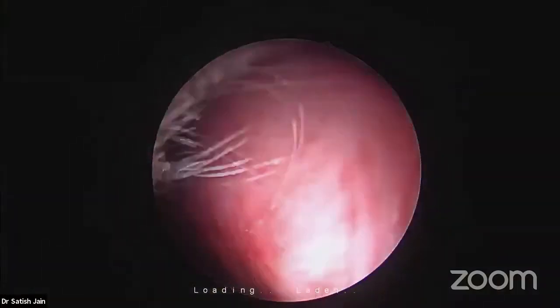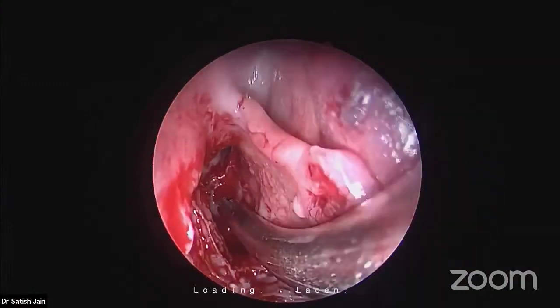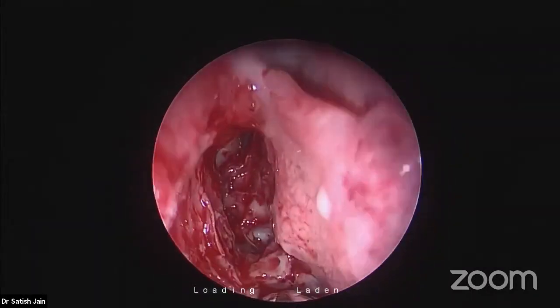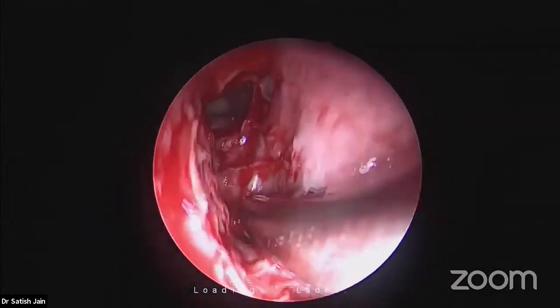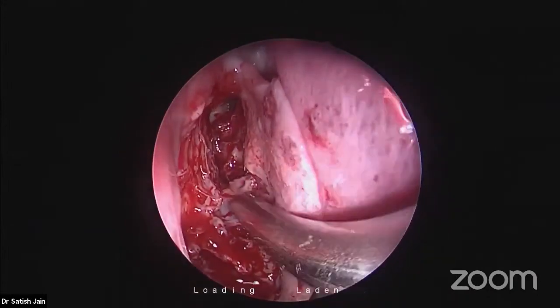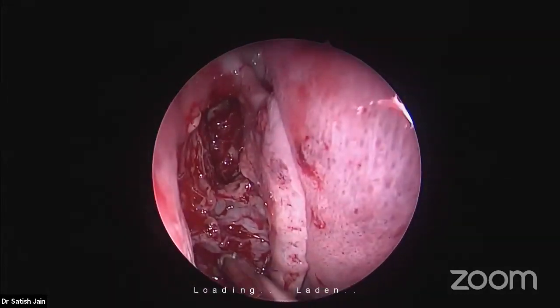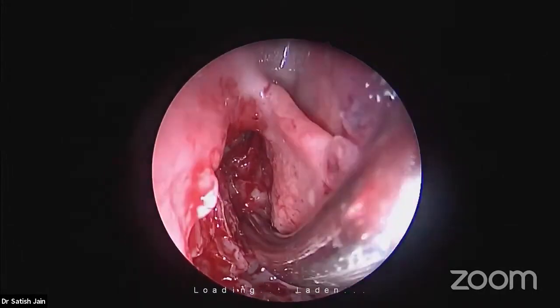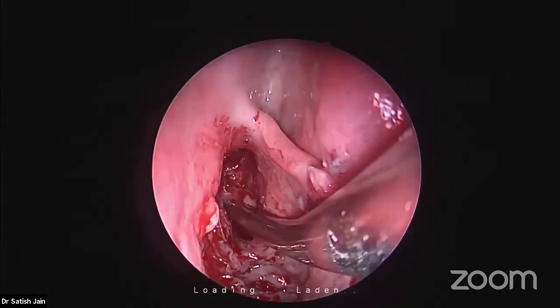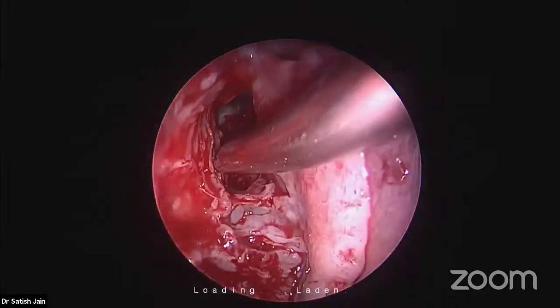See now, what we have done, we have removed the bulla. And now what we have achieved, we have exposed the anterior ethmoidal artery running along the skull base. See that? Now, in the situation Dr. Kranti was mentioning, with a suprabullar recess, the bulla would not have been going to the skull base. And in that situation, you would find the anterior ethmoidal artery like this, exposed. So if you work along this region, you are more likely to damage the artery, not being aware of it. Be careful.